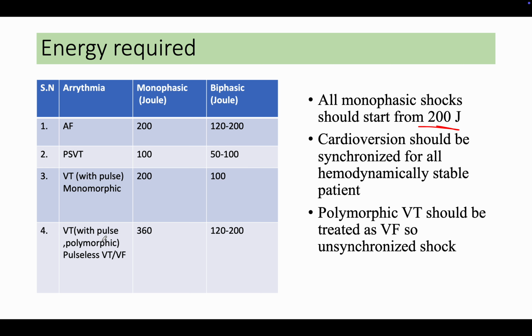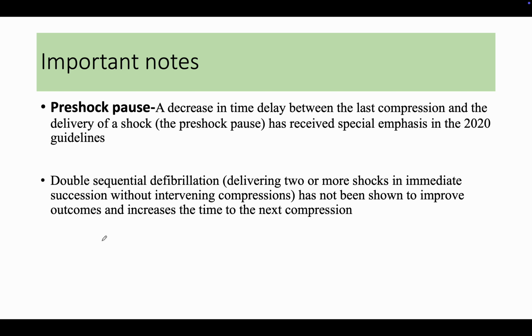That's the basic thing. The important note is the pre-shock pause. So what is the pre-shock pause? The time delay between the last compression and the delivery of a shock is the pre-shock pause, and it has received special emphasis in the 2020 guidelines, which recommend decreasing this pause time. If you decrease this pause time after CPR when giving defibrillation, the chances of successful defibrillation will be better.